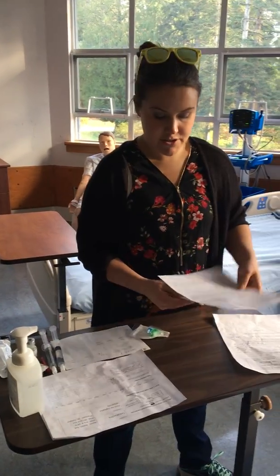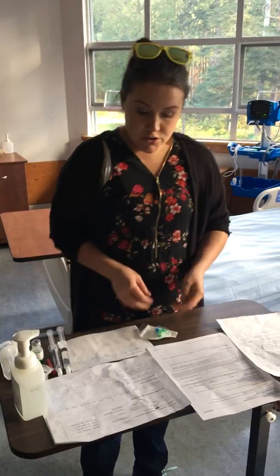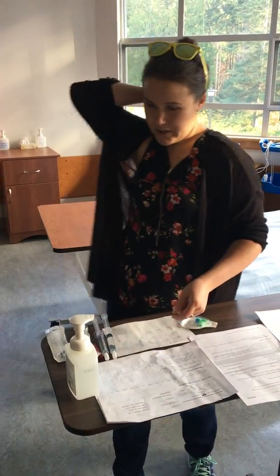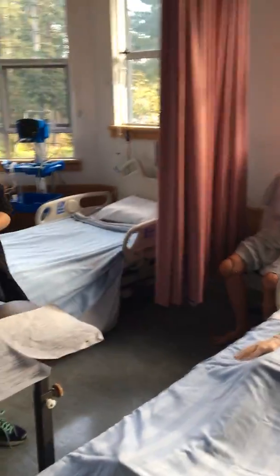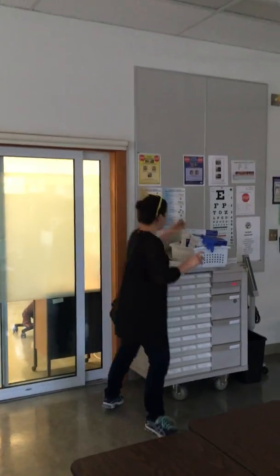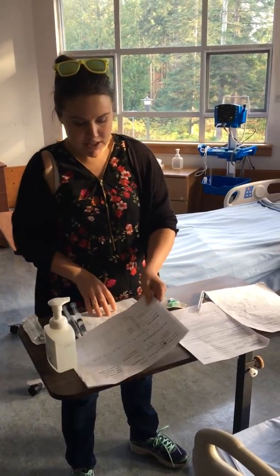And I'm going to check the adverse effects to know what I'm monitoring my patient for after. So I'm also checking that it's on her... Oh shoot, I don't have a pen. Maybe there's one at the... I'm just going to go over to this med cart and look for a pen. Oh, here's one. Okay, so I have a pen now. I'm checking that it's on the MAR.